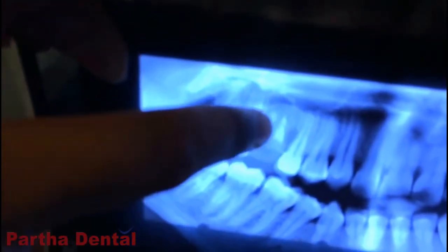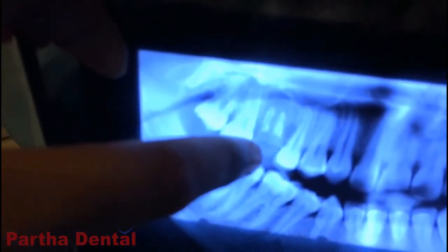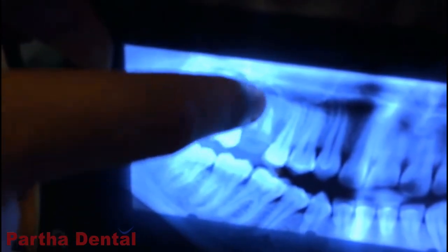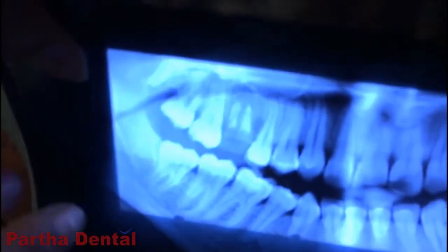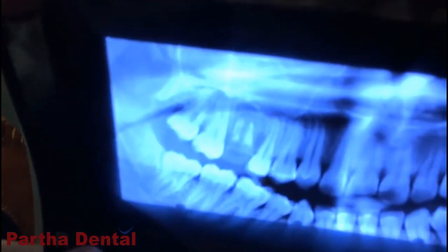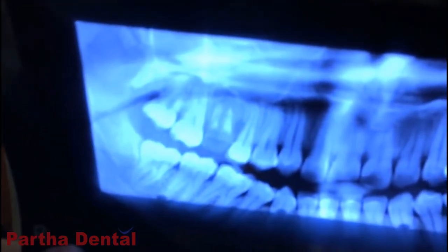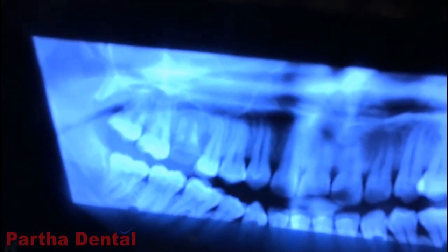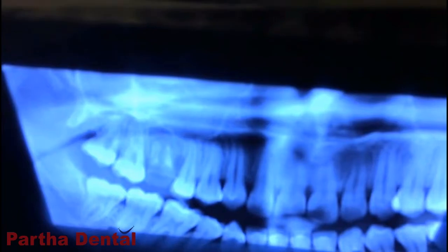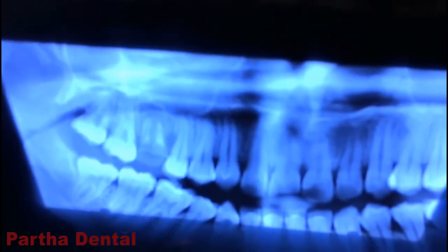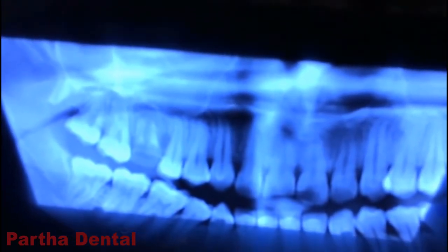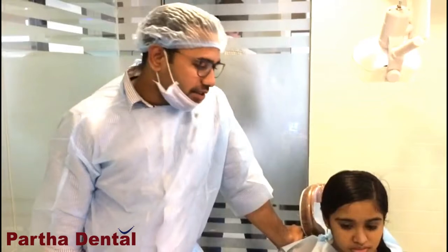Let's have a look. This is her x-ray. This is our senior implantologist, Dr. Mohan Krishna. He is a cross-closure implantologist. Today we are going to place an implant for this patient.